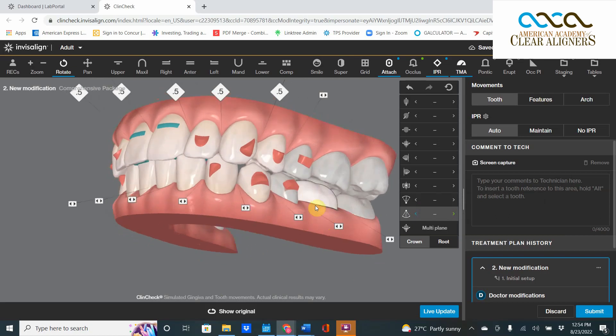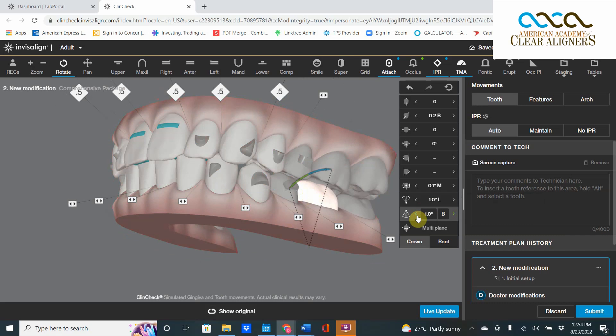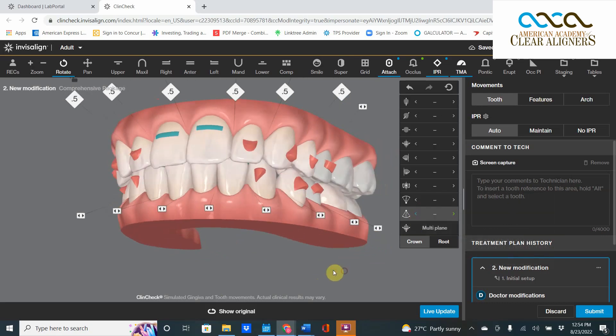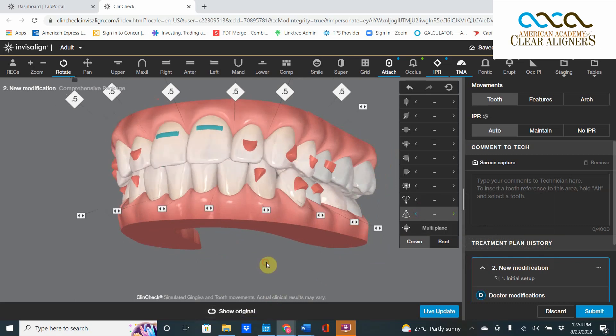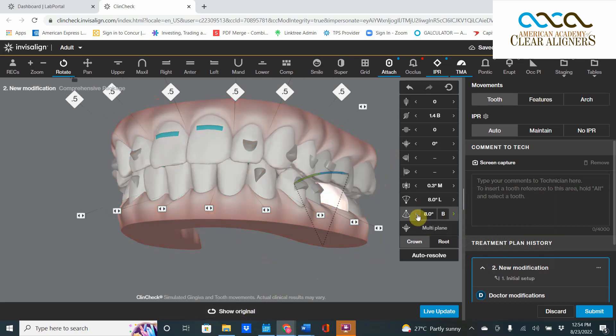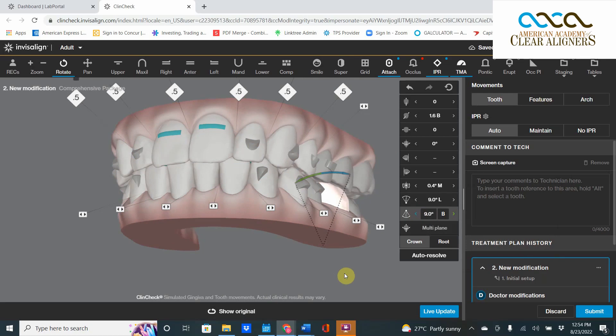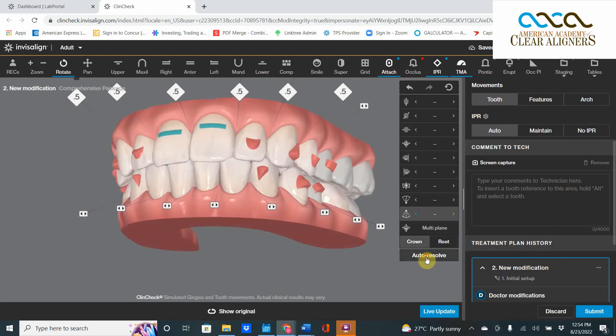She's tipped all the way to the lingual. Buccal crown torque everybody, all the time. Look at that, that's a nicer little finish. That's how Invisalign wanted to end it, that's how I'd end it. Let's do a little more. We'll call it Crazy Day today. Boom, buccal crown torque. Picked up a little interference, no problem. Always hit this Auto Resolve button to solve that interference. And we got these guys, beautiful occlusion here.